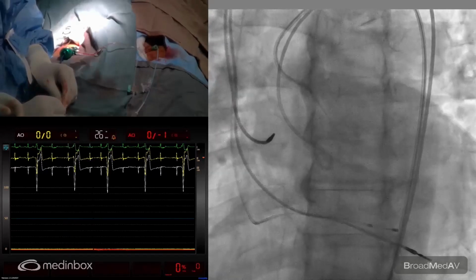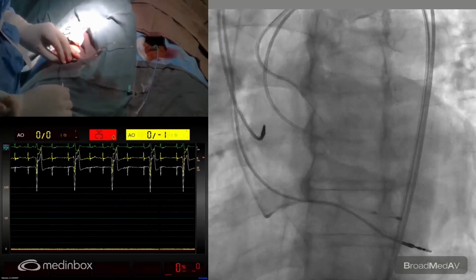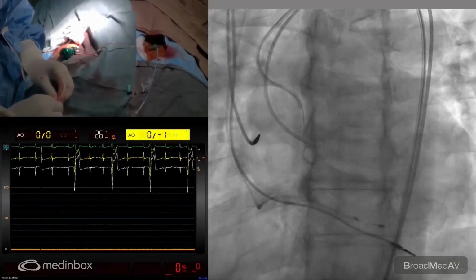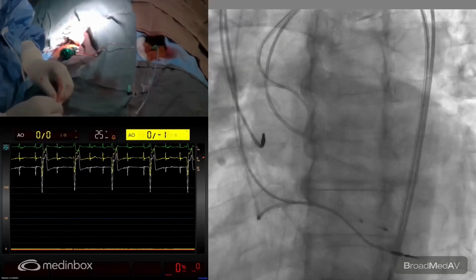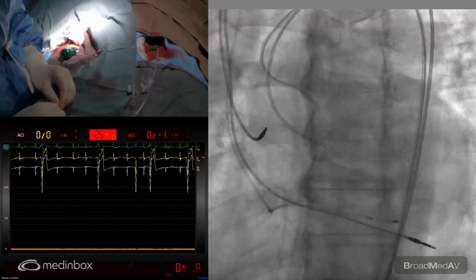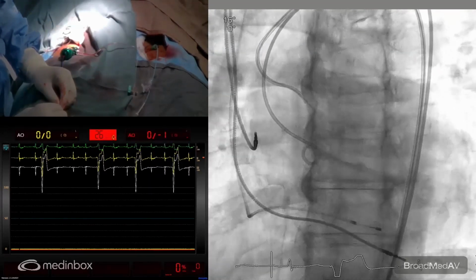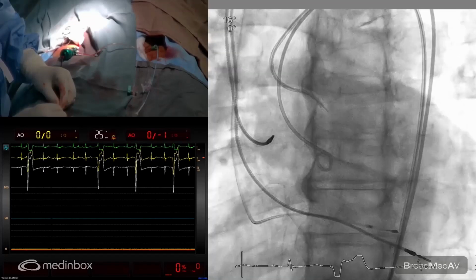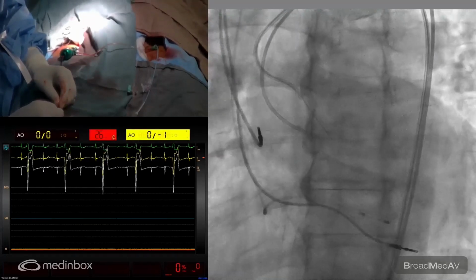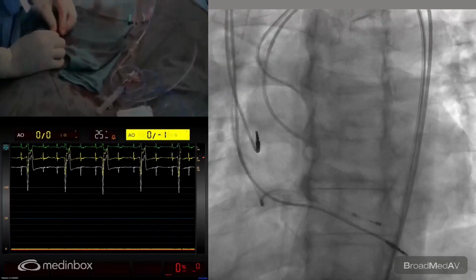So you have crimped at 2 o'clock, right, with one commissure? And the skirt distal for aortic valve. So first confirm, I'm confirming skirt distal. You are also okay? Okay, right. So you're just looking at where the valve is opening. It's a tight valve, as you know. It's 0.8 square centimeter. So there is a bit of AR, so that could help in crossing.